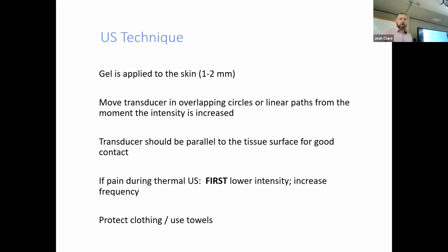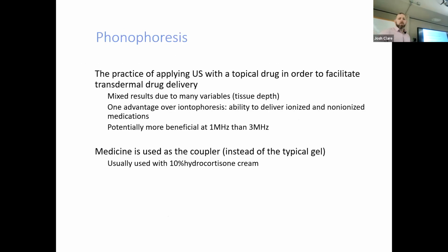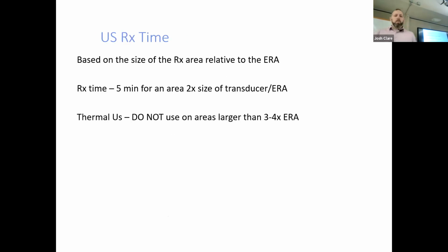All right, that's time. I already talked about that. We'll talk about phonophoresis next week, I think. So what we're going to do next is play around with a bunch of our machines. Some of the settings on it, how we use this machine versus those are a little bit different. I really like this machine for ultrasound. Really simple. I think we have another one over there. We do have one other machine. I think it was made in 1947. We'll break that one out.